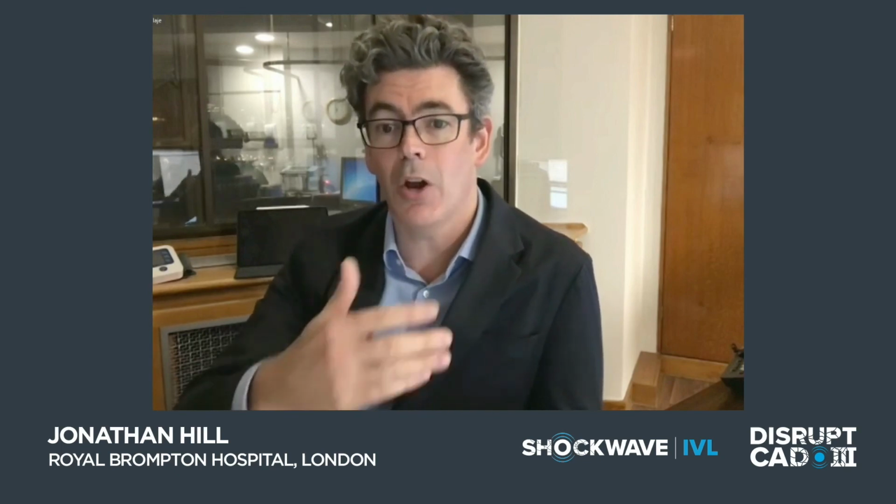And his prediction was that, if we're doing the intravascular imaging, screening the patients appropriately, and using our angiographic interpretation skills, 10 to 15% of PCI overall may require some form of calcium modification. So I think we're at a point now where there's going to be a huge expansion overall, not just in IVL, but in all the other forms of calcium modification, because we're all becoming much more calcium aware.